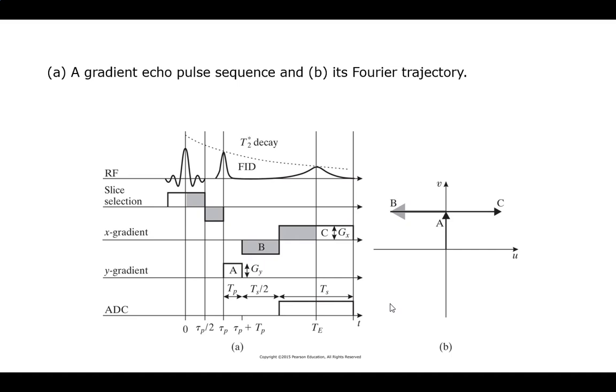So I have to initially, in the x direction, kick it back. That's the movement of B. So I set the x gradient coordinate. Remember, this and this, half of it have to be equal because I'm trying to read symmetrically about the axis. This is going to be how much time you basically got with the number of samples that are going on. It is going to determine your resolution and frequency range. Making them equal gives me a symmetric measure.